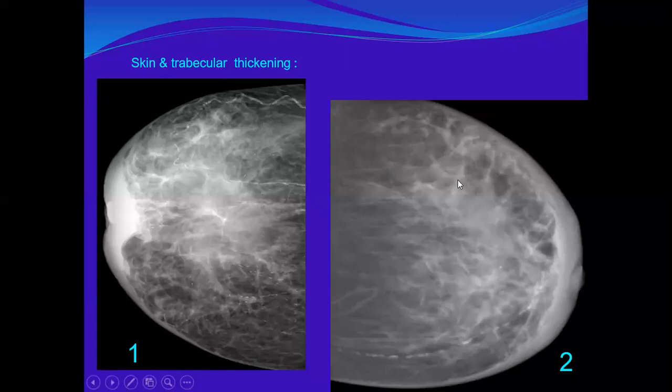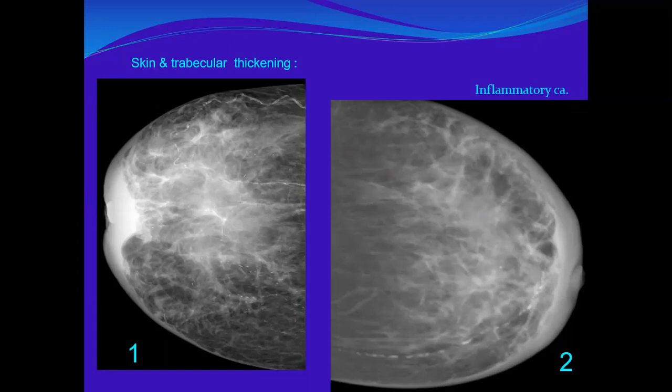Both cases are malignancy. And in case of inflammatory carcinoma, what do you expect? Sometimes the underlying breast malignancy is much less presented on mammography. If I remember, around 60 plus percent can demonstrate the malignant masses. Why? Because of the overlying edema, and because usually in inflammatory carcinoma the masses are small interconnecting nodules rather than a large mass. That is why MRI is superior to mammography in presenting the abnormality. You see, this is an inflammatory carcinoma.